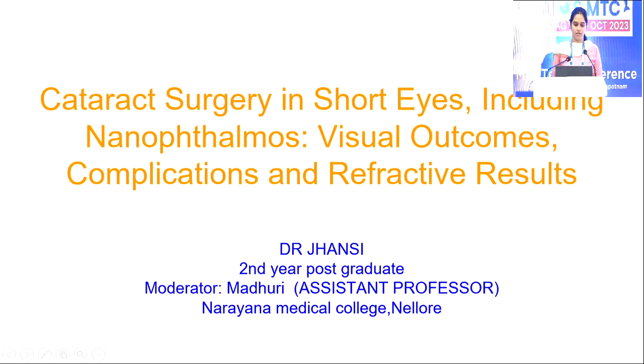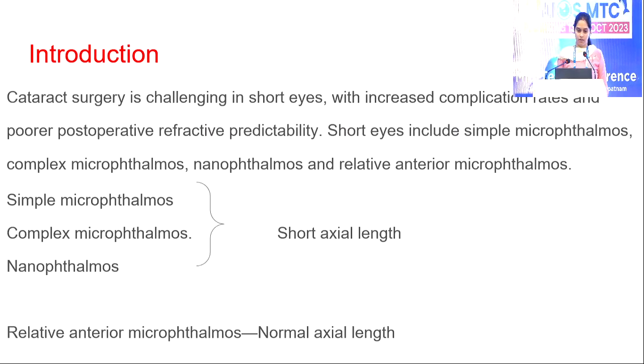My presentation is on cataract surgery in short eyes including nanophthalmos, visual outcome, complications and refractive results. Introduction. Cataract surgery is challenging in short eyes with increased complication rates and poorer postoperative refraction predictability. Short eyes include simple microphthalmos, complex microphthalmos, nanophthalmos and relative anterior microphthalmos.